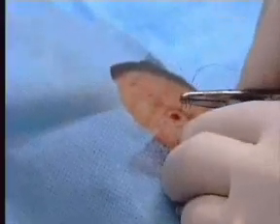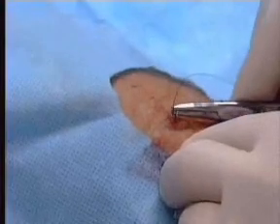What you will see is the mole with a very small circle of regular tissue around it. The tissue is then sent to the lab for biopsy. A small punch mark hole remains. Close the wound with a stitch, though occasionally a second stitch is required.